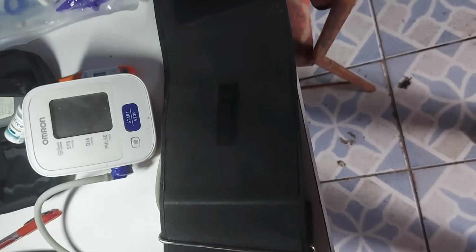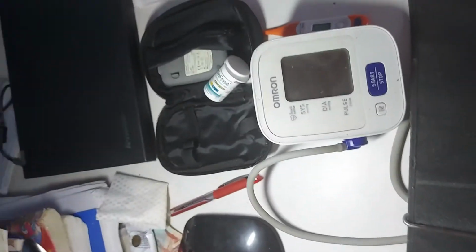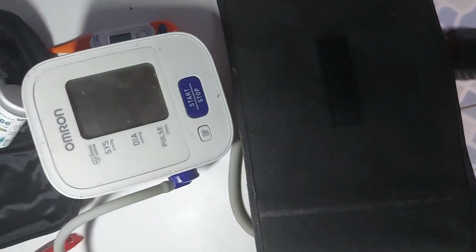Alright, so we begin this video by showing the different types of equipment we have before we do any assessment or any interaction with the patient. We got our equipment, so we have our blood pressure machine, temperature, the RBS machine. We also have things to shave the patient, as well as the trays to administer medication, as well as to put away certain items from the patient.